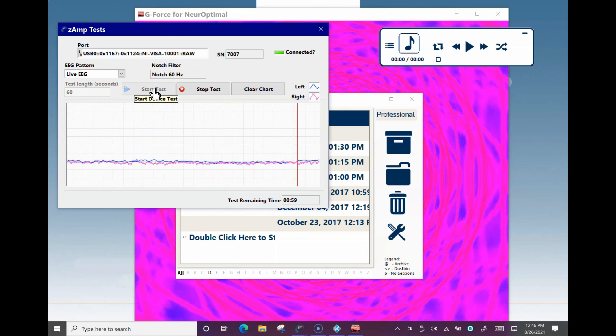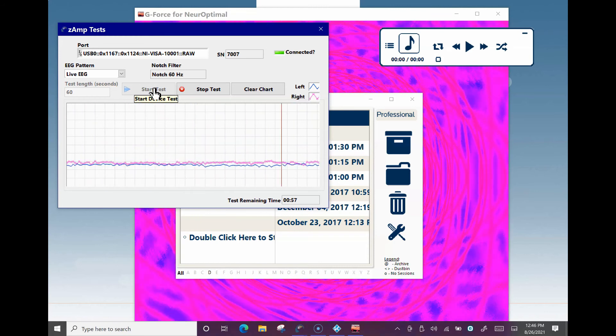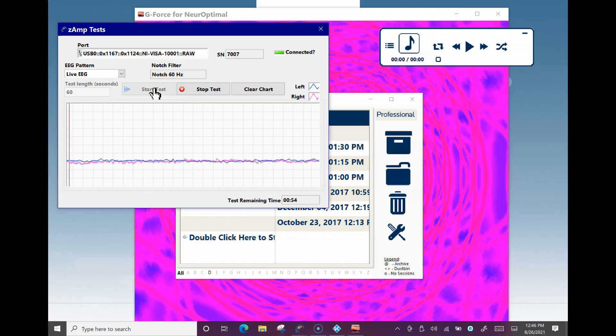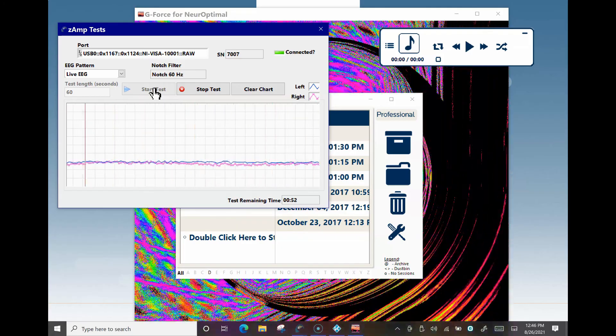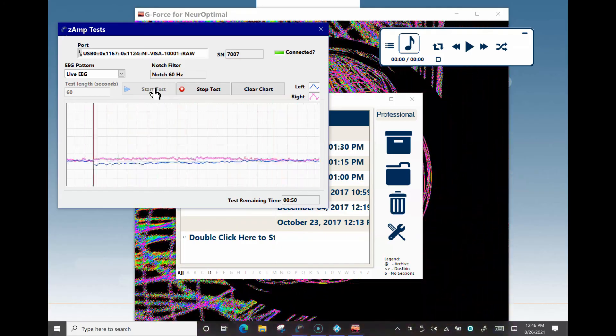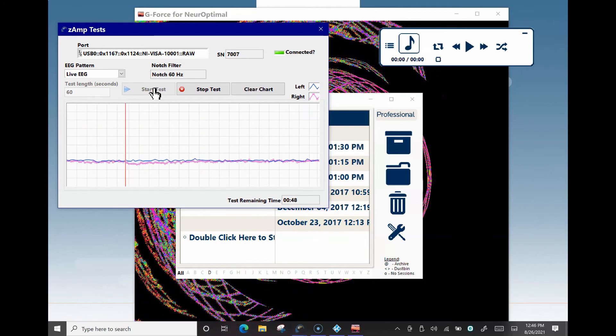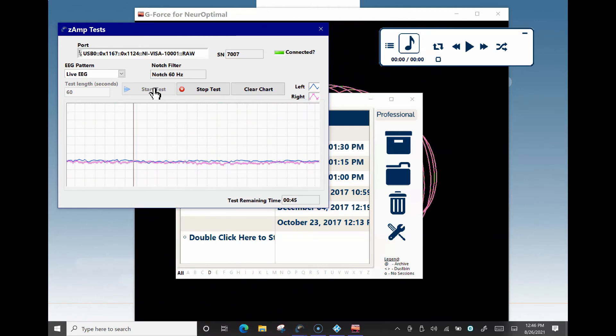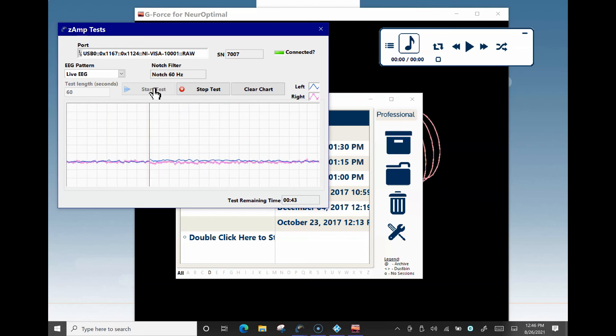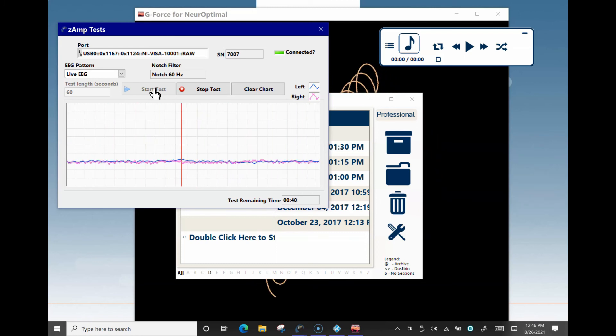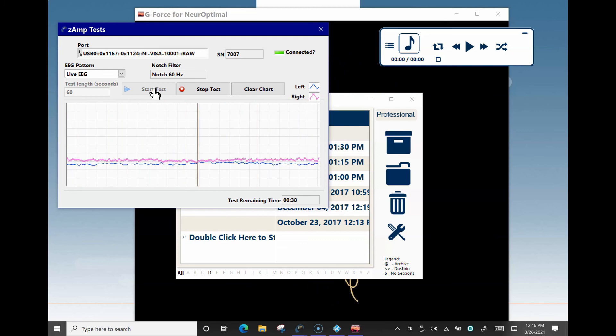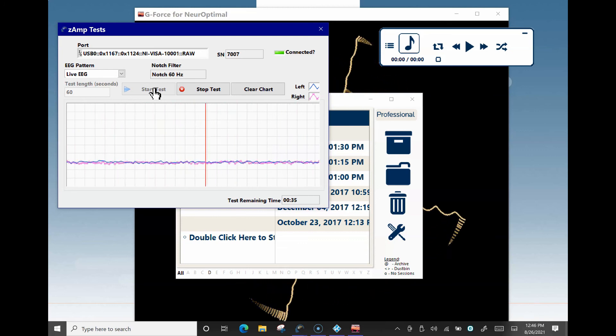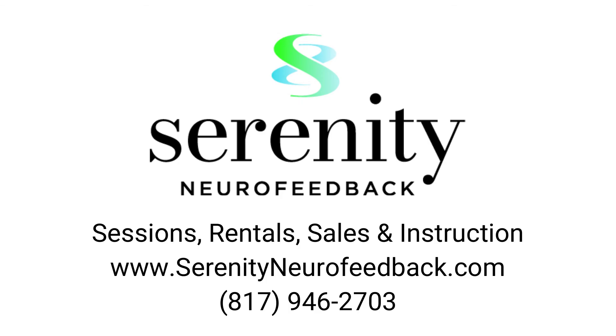If you continue to see spikes after redoing the test, the sensors are no longer reading signal properly and may need to be replaced. If your sensors do not zero out, please take a screenshot or photo of the screen showing the test and email it to us so that we may check the results and send a new set of sensors out to you if needed.